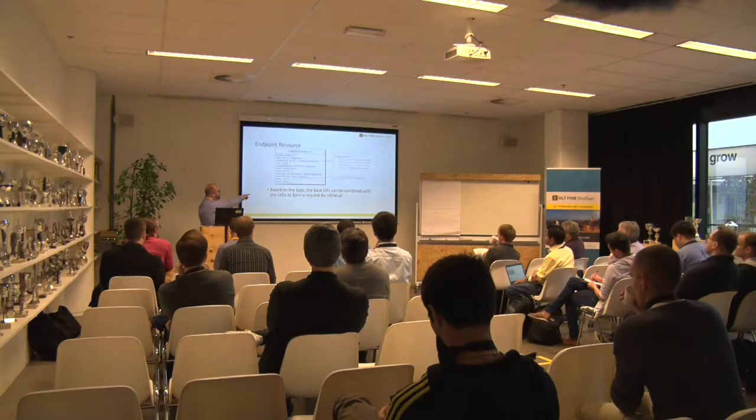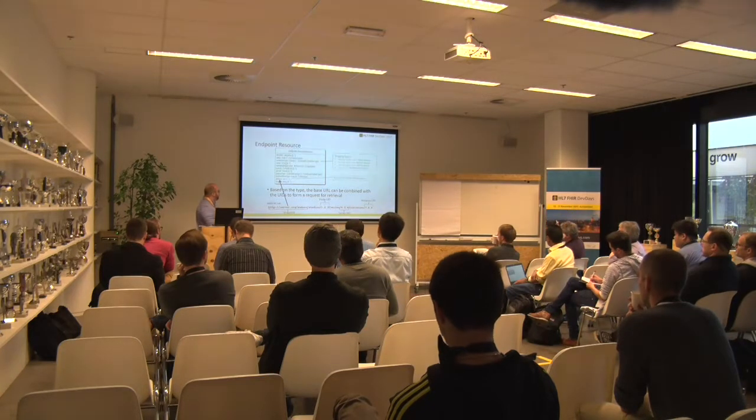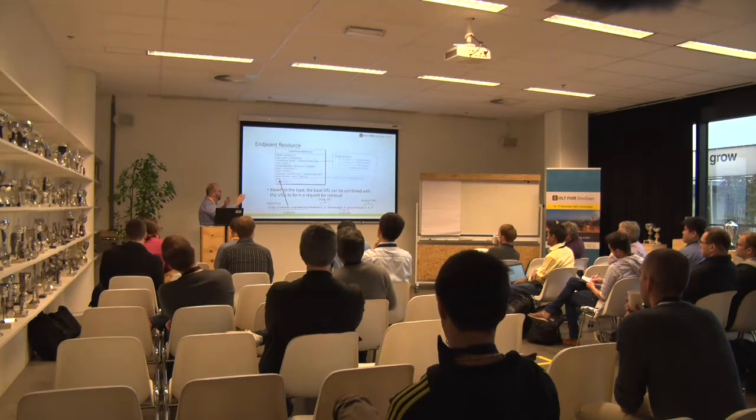And then the base URL, the address, is where you can get started with the service to actually construct the URL. So we would take the address, add in the study, series, or instance UIDs from the imaging study objects, and we create a full URL, and you go and grab those images right away.